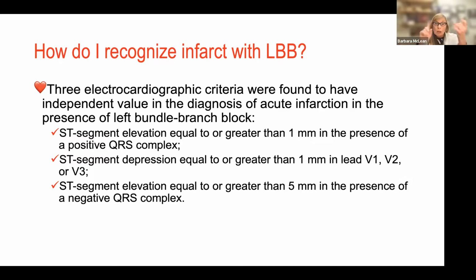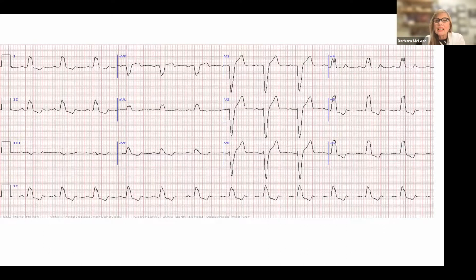It's straightforward. Concordance and degree. Okay, concordance and degree. Fantastic. So when we look at this, we say, oh, axis is normal. Whoop, terrible R wave progression. Zone of transition, V4, really wide.